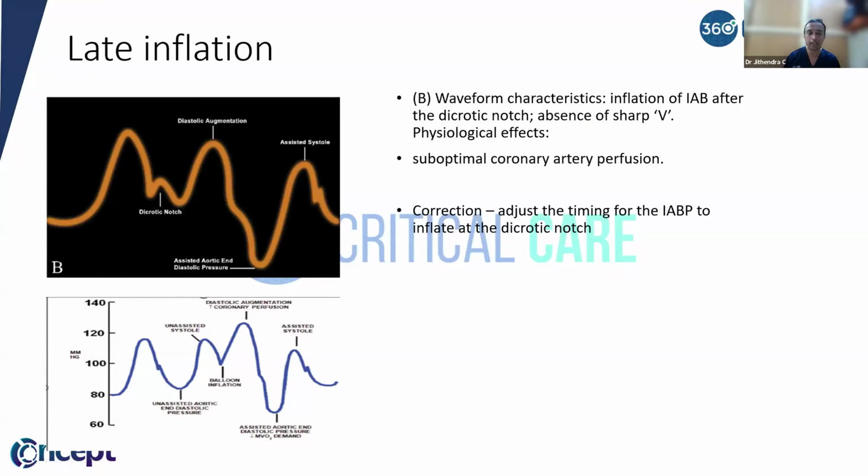Okay, so how do you fix it? Again, adjust the timing. So ask the balloon to inflate a little early. That is what you will be doing.